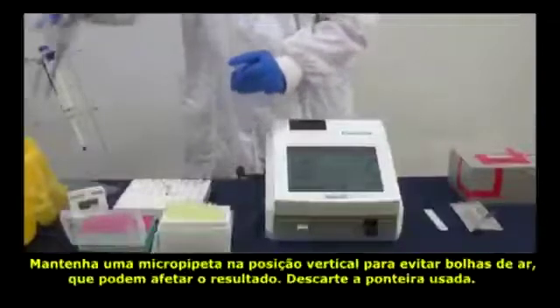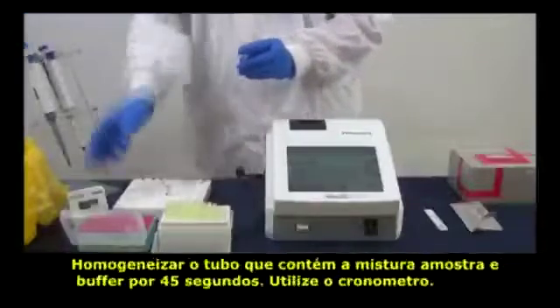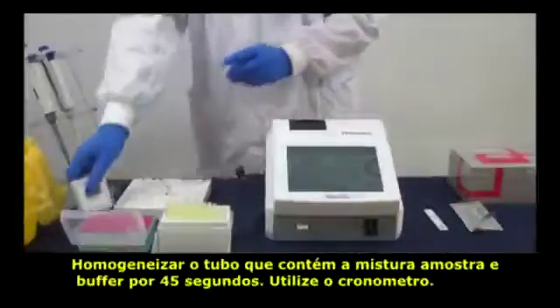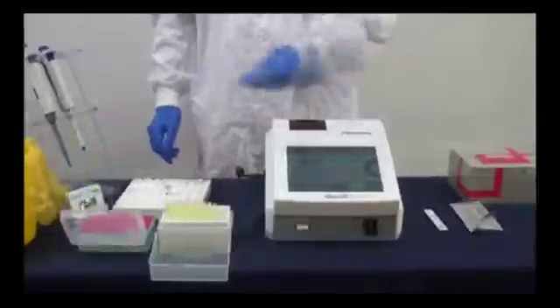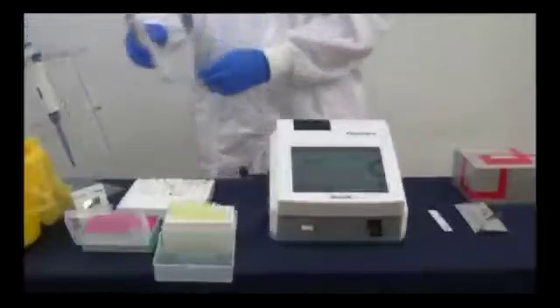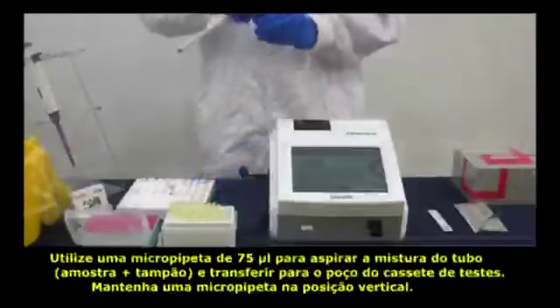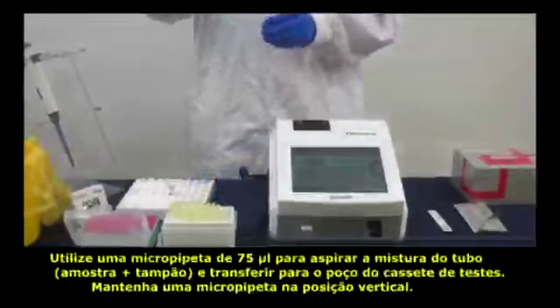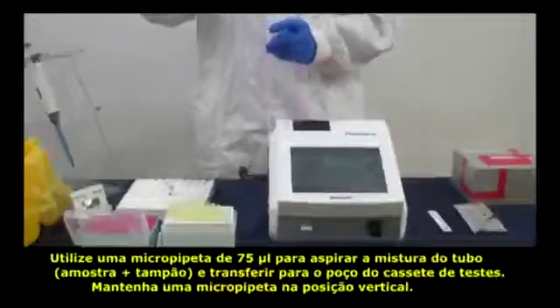Discard the used tip. Mix the sample with buffer for 45 seconds — remember to use the timer. Then use another micropipette to add 75 microliters of the mixed sample into the well.